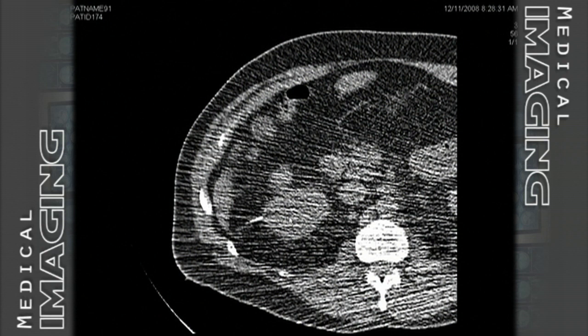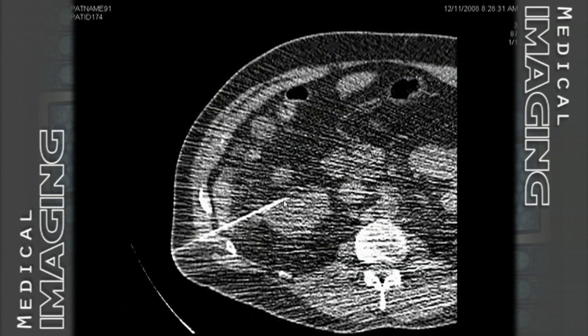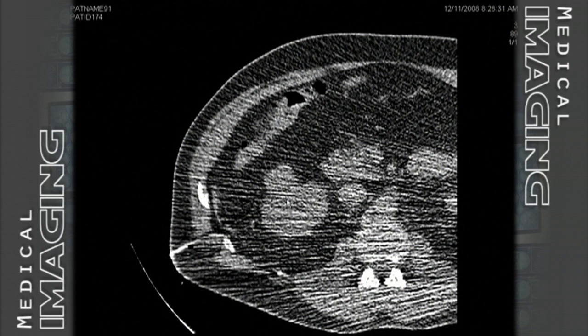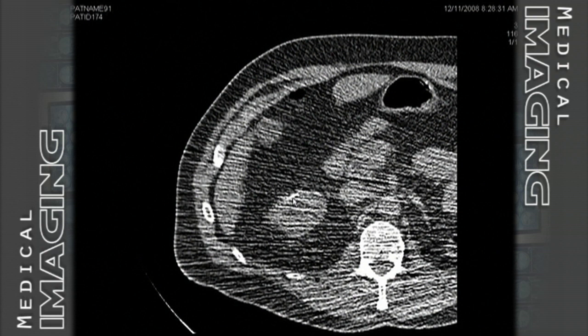Once they confirm the location of the needle tip, then they will further localize where the probe is going to go. Now here is the needle in profile, but we still don't see the tip. So chances are the tip is between this slice and this slice. So we may see some additional manipulation and reinsertion of the needle. Okay, there's the needle there where the arrow is, and they may introduce another needle to better localize where the suspected mass is best entered.